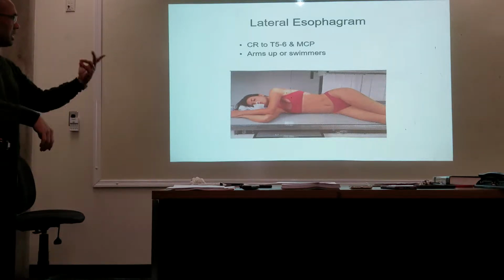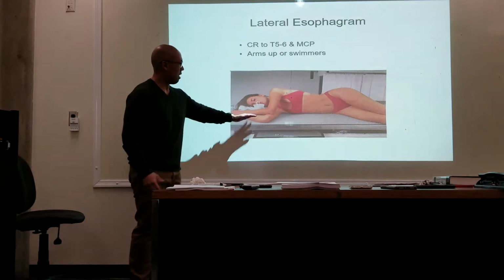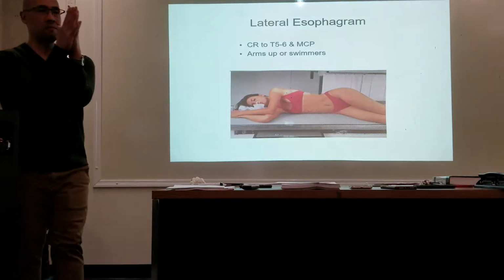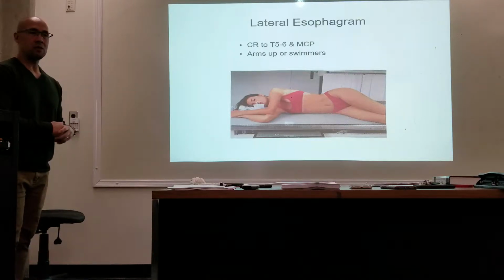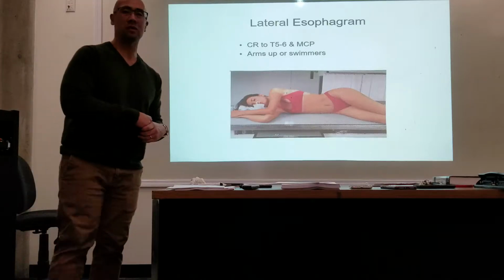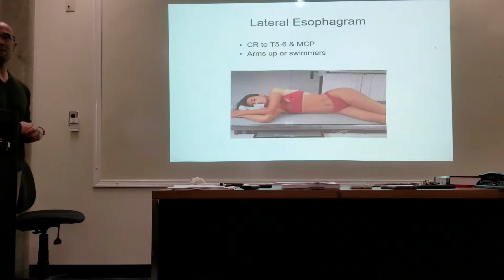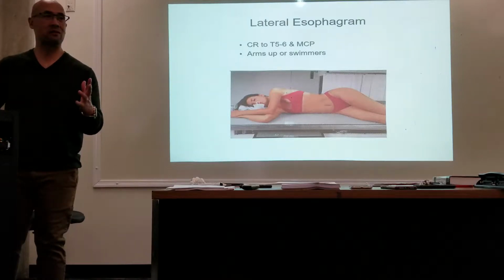Okay? So they're laying on their side, legs slightly bent, one on top of the other, keeps their balance. Arm in front of them like they're praying. Okay? Again, maintains the balance. Assist them by putting the straw in their mouth. Okay, here we go, Miss Jones. Are you ready to go? Okay, drink and swallow, drink and swallow, drink and swallow, drink and swallow. Boom. Okay, stop drinking. Got it? All right. Any questions so far?